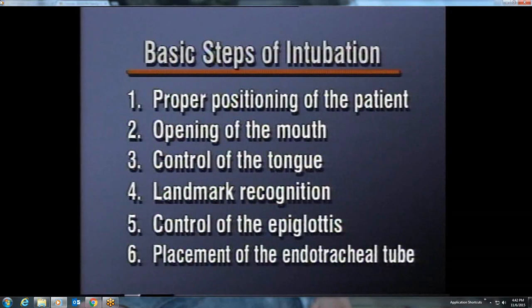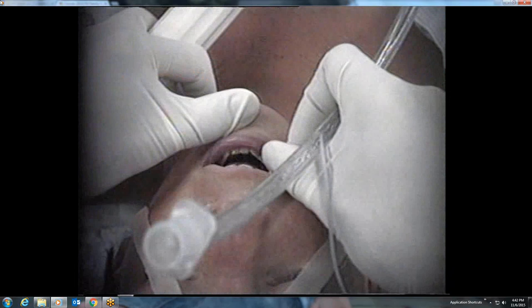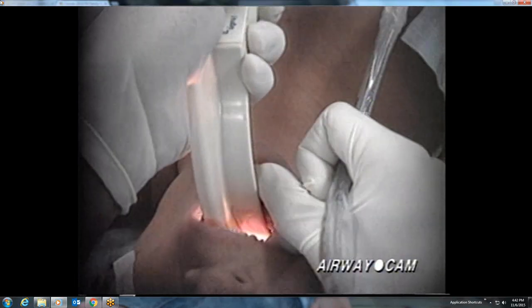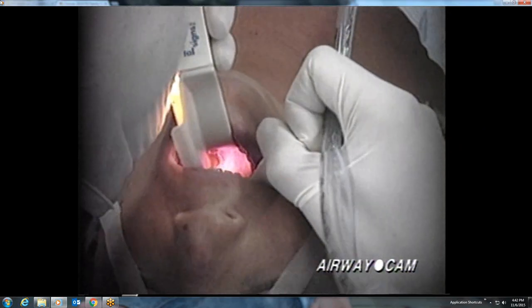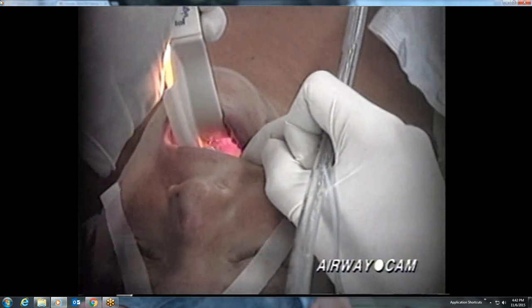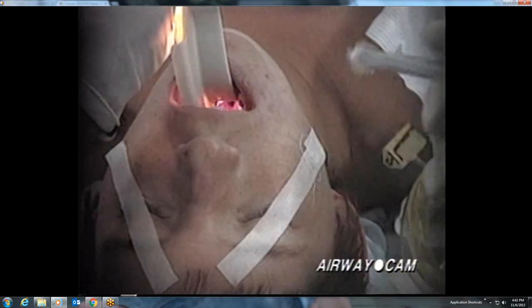Now that we've reviewed the basic steps of direct laryngoscopy and intubation, let's review intubations from start to finish as recorded in the operating room with the AirwayCam direct laryngoscopy video system. This intubation is done with a Macintosh III blade with a fiber-optic light source. The scissor technique is used to open the mouth, and the posterior pharynx is then visualized. The brightly lit edge of the epiglottis comes into view, and traction in the direction of the laryngoscope handle exposes the glottic opening.